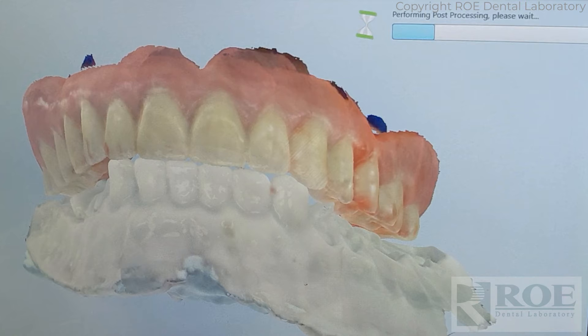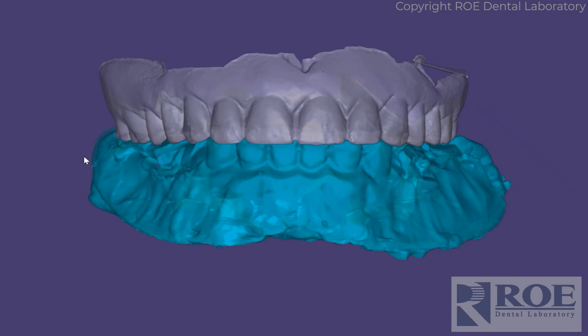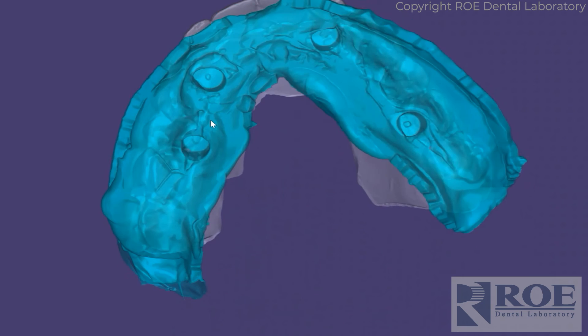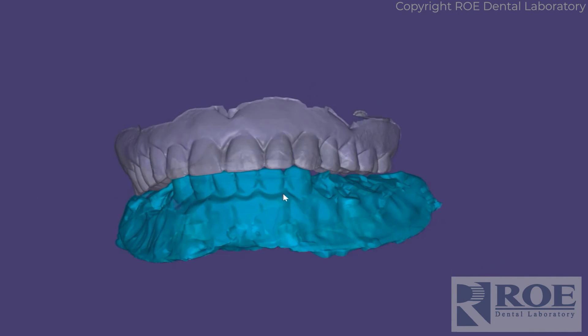So now you can see the records: a complete denture with bite and intaglio, an opposing, the ICAM scan ref scans that give us perfect position of the implants, and an impression of the healing collars and the new tissue after extraction and bone leveling. With that, our laboratory designs a prosthetic. So that's the digital records all put together: intaglio, the denture, the denture custom tray, the opposing, and the bite.